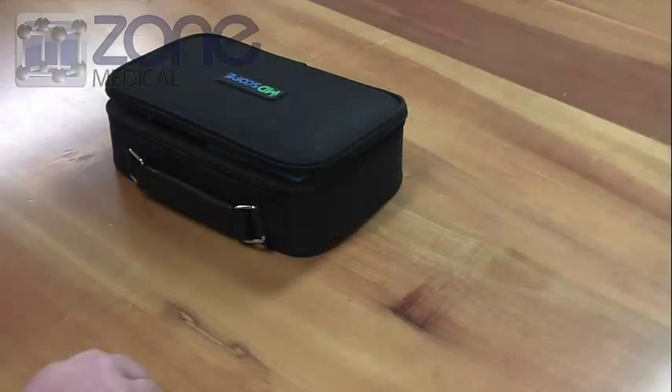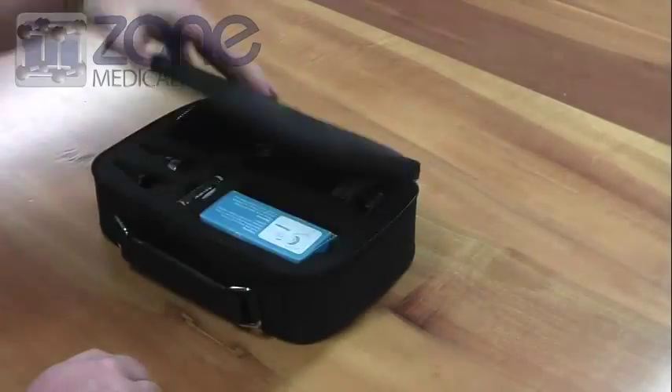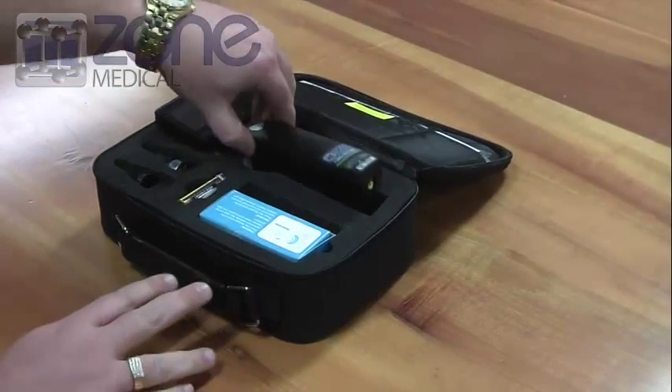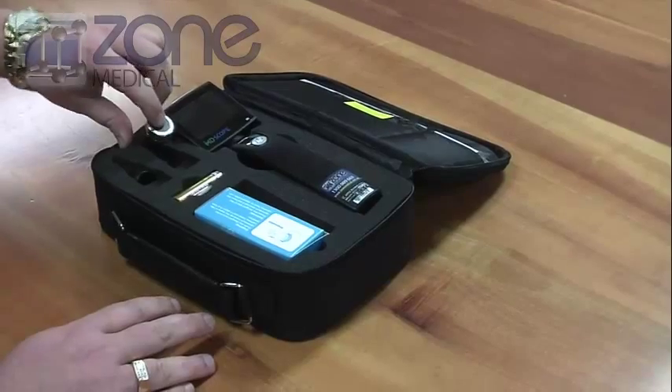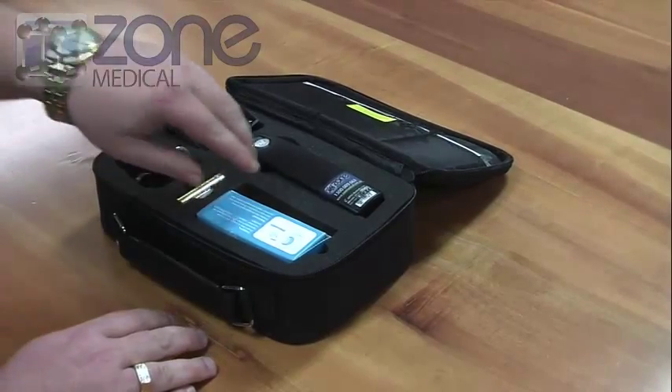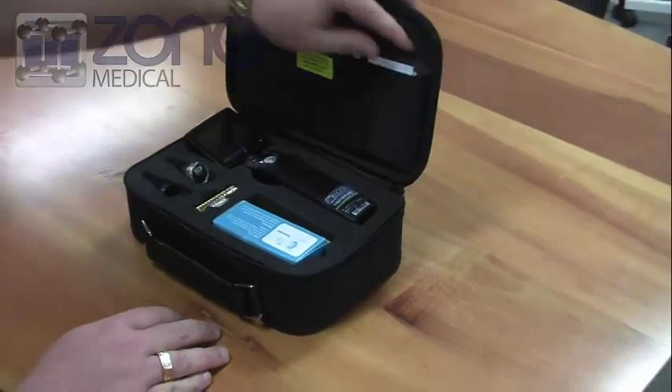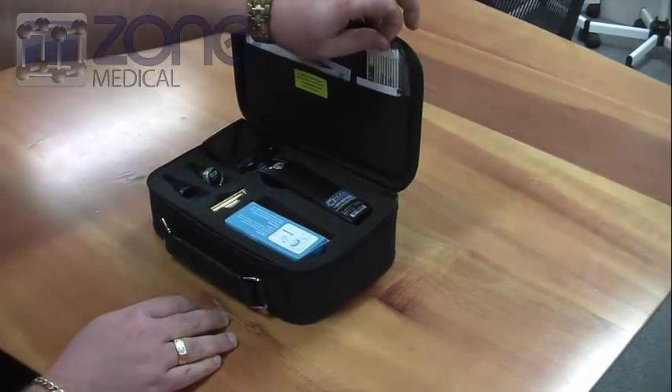Introducing the Apple Video Otoscope. This is the kit. Inside the kit you have your video otoscope, basic lens, AA batteries, specular, instruction manual, and earbuds.